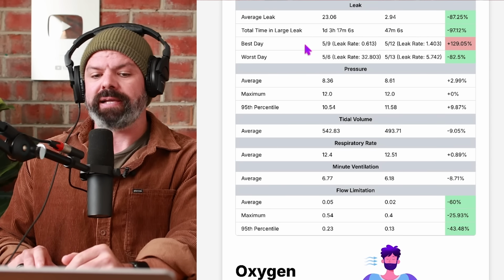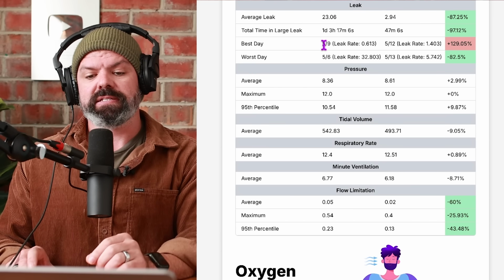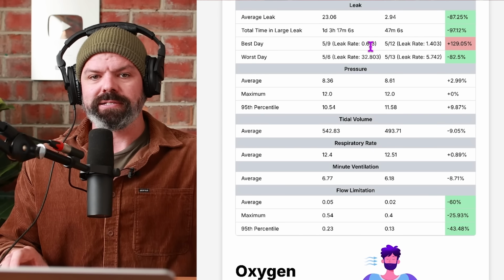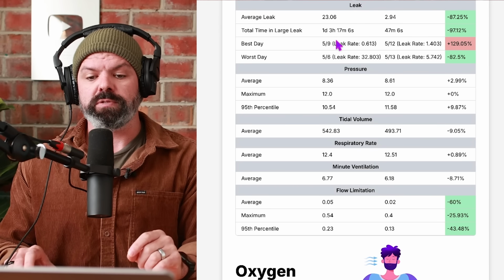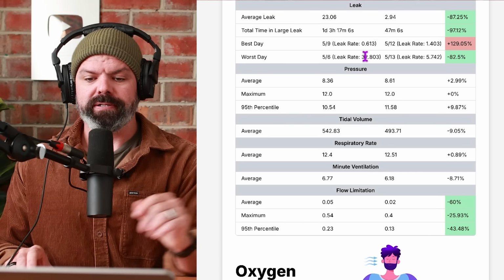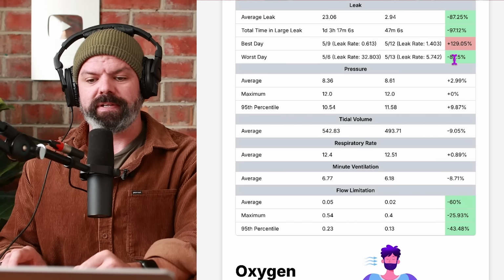Now the best day, so this is the best day of the prior week versus this week. And you can see here that his best day, the 5th of the 9th, 0.613, that wasn't with this mask. All right, there's a bit of overlap in the weeks there. So his best day was both with the Solo. All right. And then the worst day, 32.8 versus 5.7.